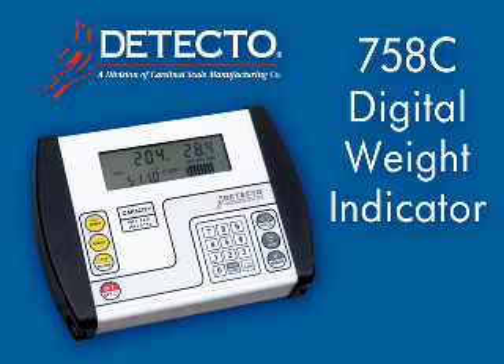This video will explain these functions and show you why the 758C indicator is the perfect choice for scales in hospitals, doctor's offices, weight loss clinics, long-term care facilities, or anywhere accurate weight is required. One of the great features of the 758C is that with all of the incredibly diverse functions it is capable of performing, it can also be used very easily for basic weighing without any learning curve.